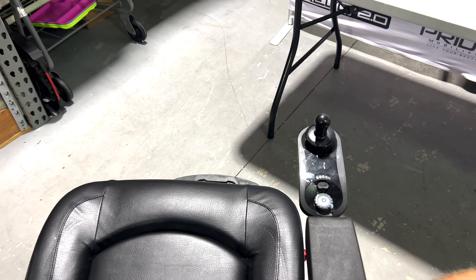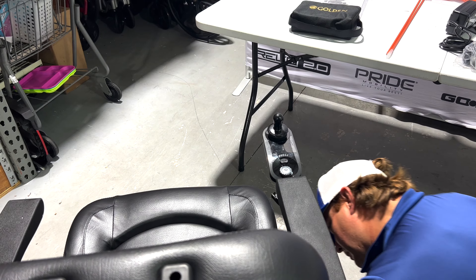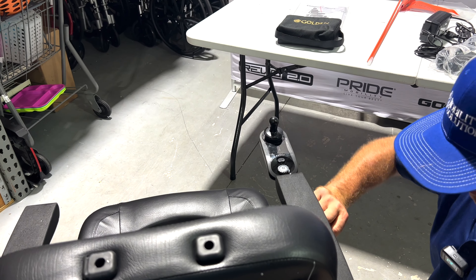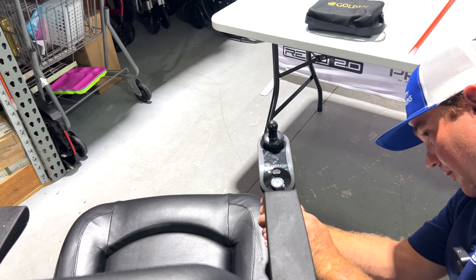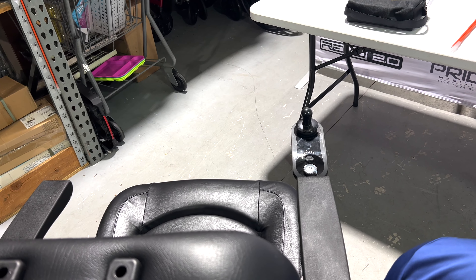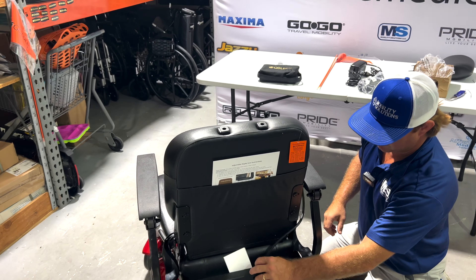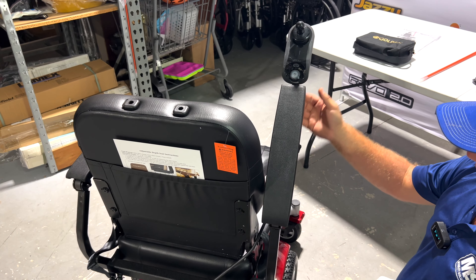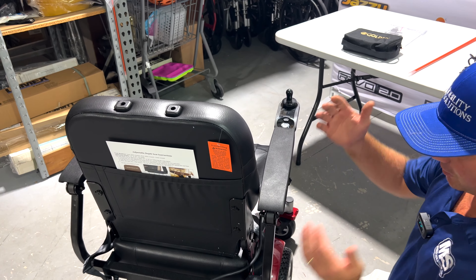This is going to be moved in and out. If you're going to be moving this up and down, you might want to not put the cord clip there. You might want to just come up through here and not use that clip — just so you know — if you're going to be moving the arms up and down, because it will pull from this. Or if you bring this all the way back, you should be fine. If you have a zip tie, you can zip tie it. It's optional if you want to use that clip — there's not much room for this to come up and down, but it does keep the cord in better.